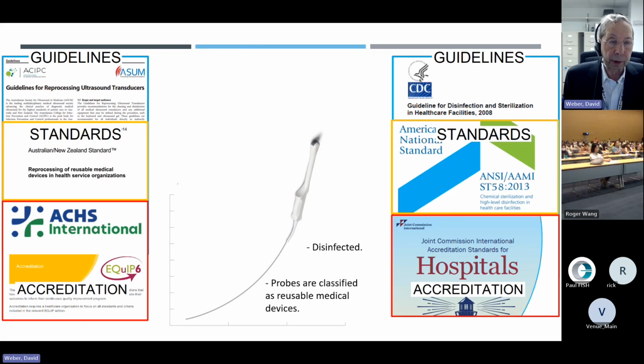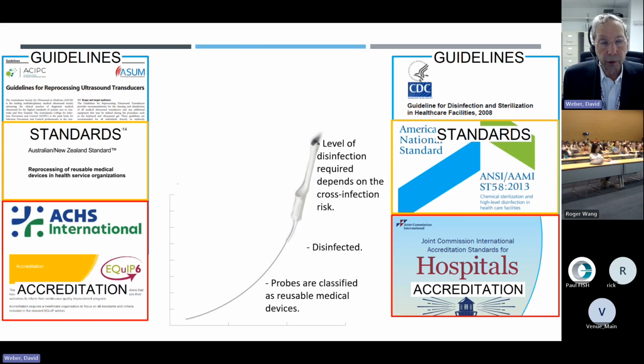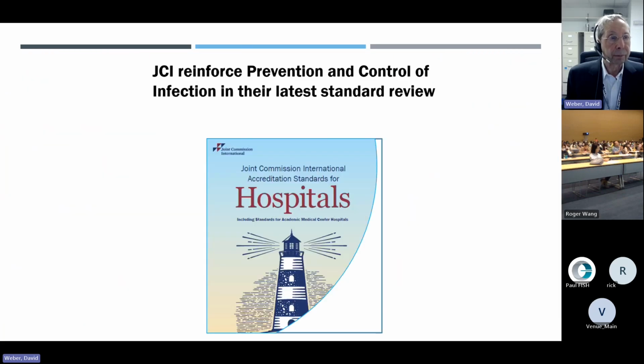They need always to be disinfected between use. And the level of disinfection required depends on cross-infection risk. So those that touch mucous membranes or non-intact skin require high-level disinfection. Those that touch intact skin require low-level disinfection.